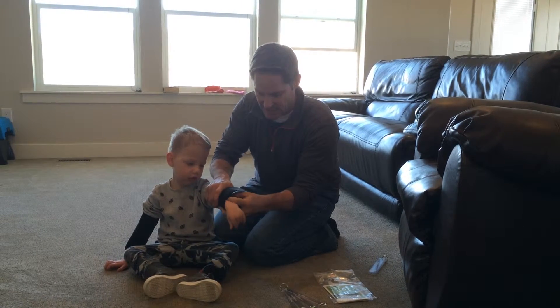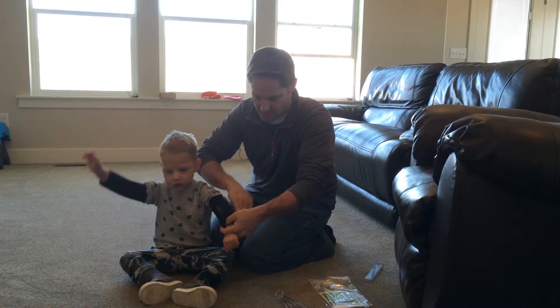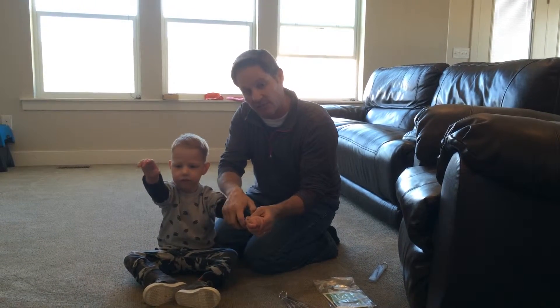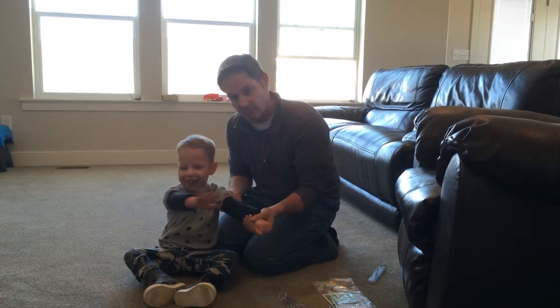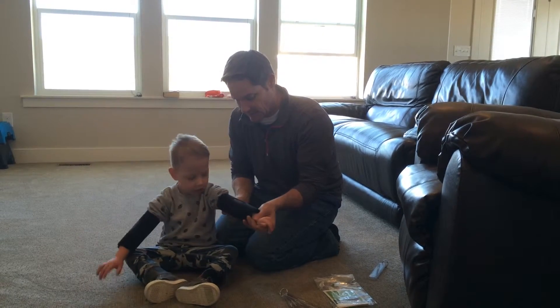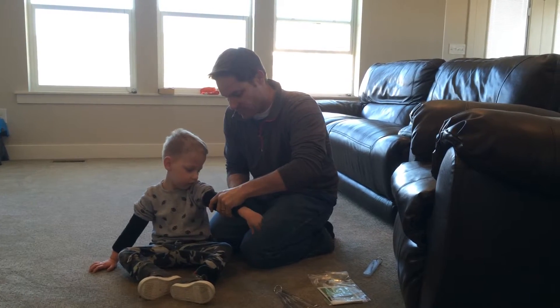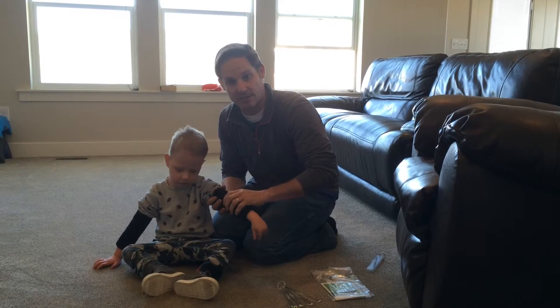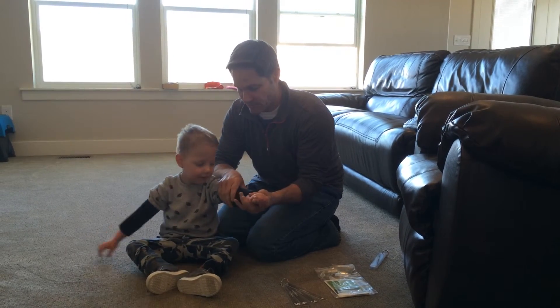His forearm might be a little bit skinnier down below than it is up top. Bronson is kind of in between braces — he could probably wear the size small. I chose the medium because he has spasticity, and also because he's right about three to four years old, where I wouldn't want his family to have to buy two sets of braces. So we're going to try him in the medium first.